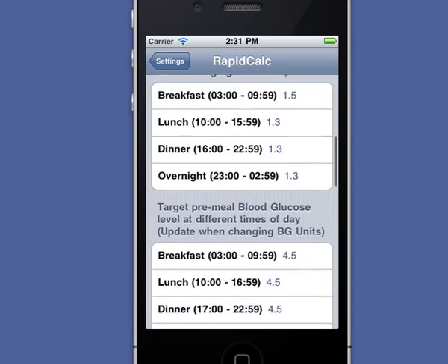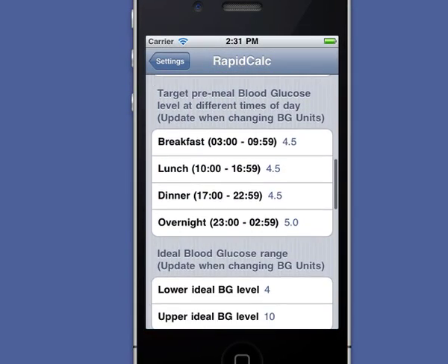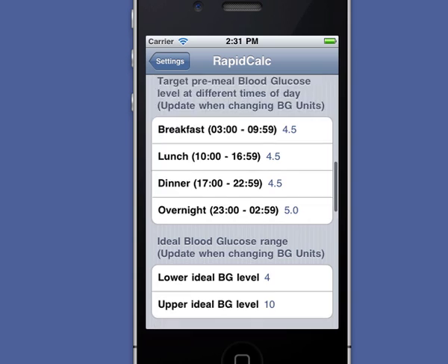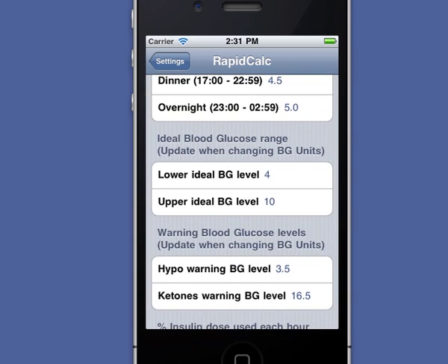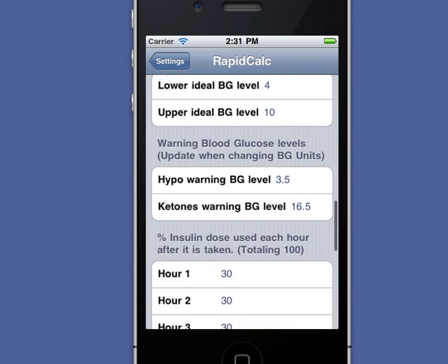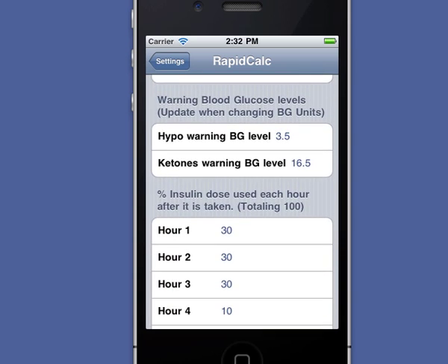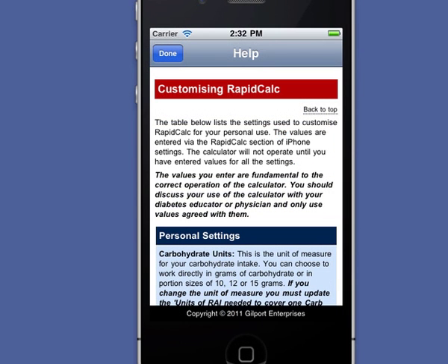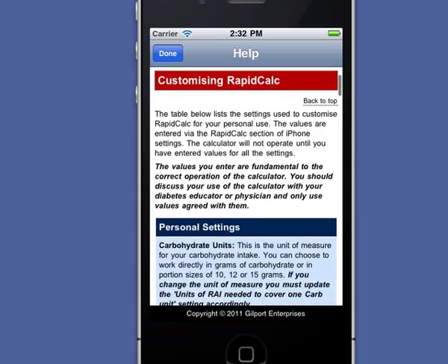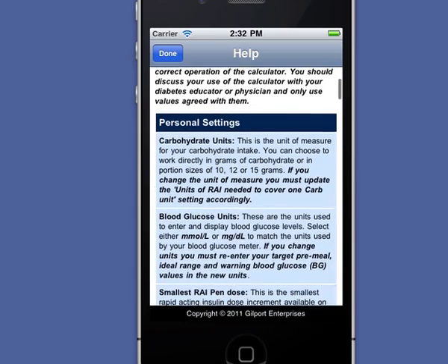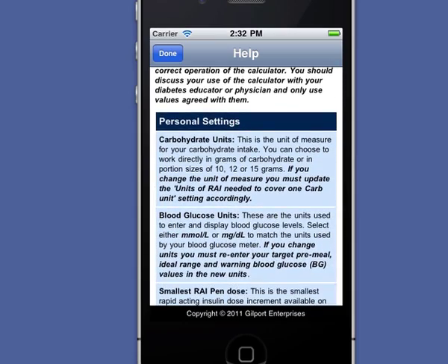RapidCalc is easily configured with your personal settings, including the profiles and ratios that you've agreed with your healthcare professional. All the settings are described in the built-in help, along with guidance on using RapidCalc.